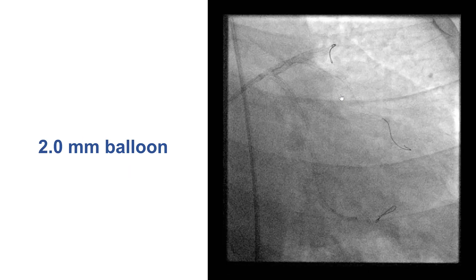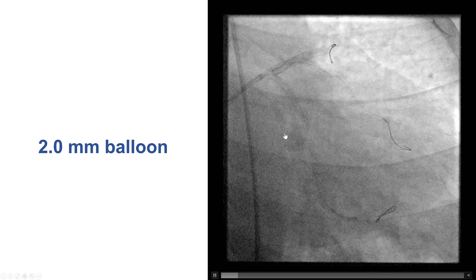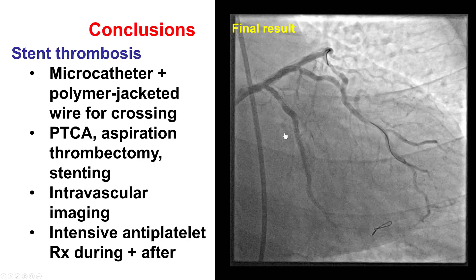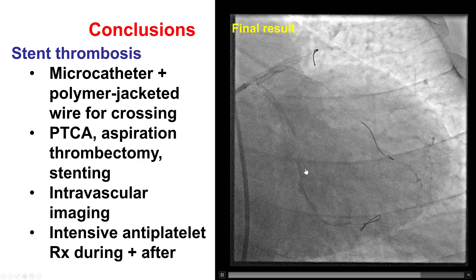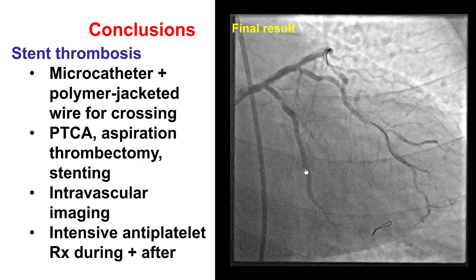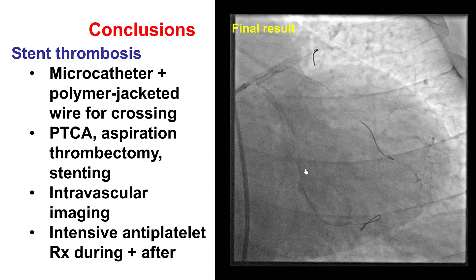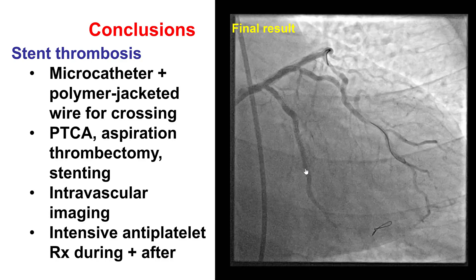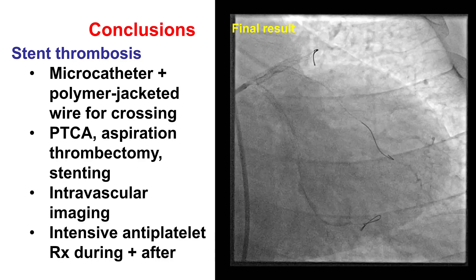Getting flow into the circumflex was more challenging. We performed several rounds of aspiration thrombectomy and did imaging — the stent was expanded, with some remaining intraluminal filling defects, but there was some antegrade flow. After multiple attempts, we decided to stop the procedure. The patient had marked improvement of chest discomfort during the procedure.